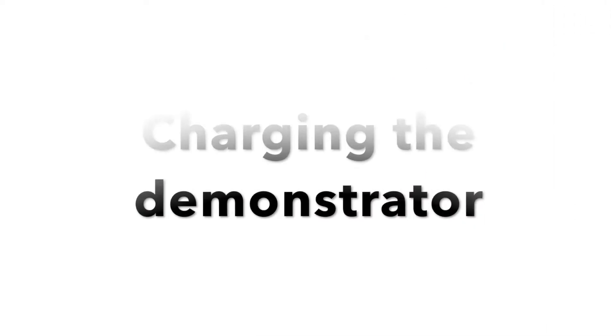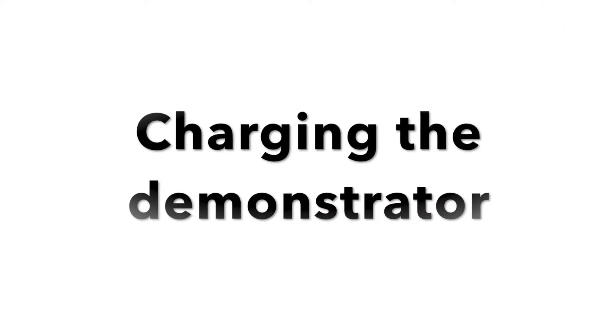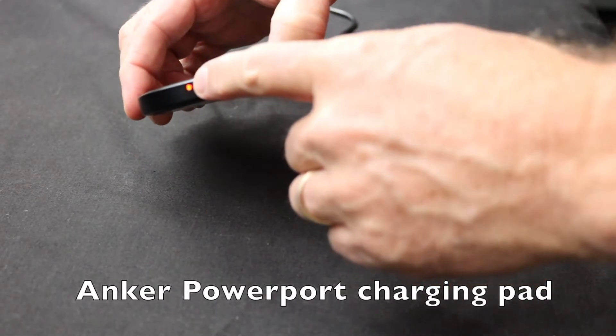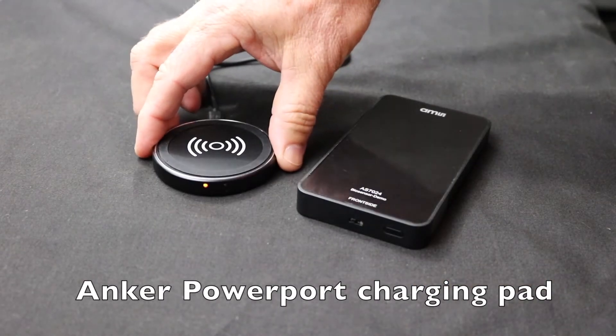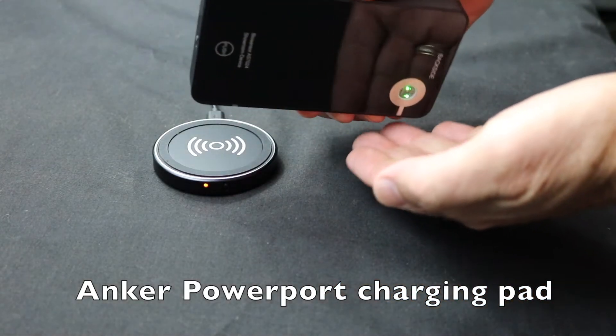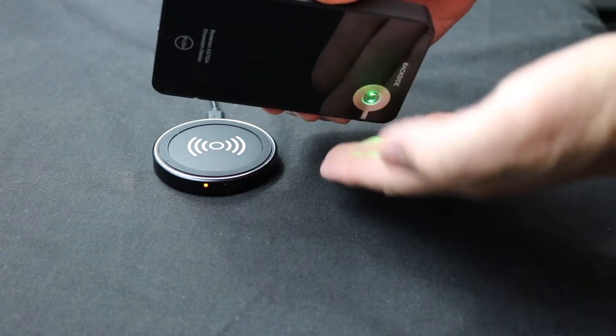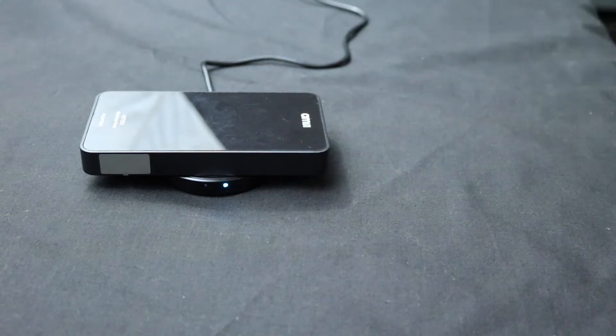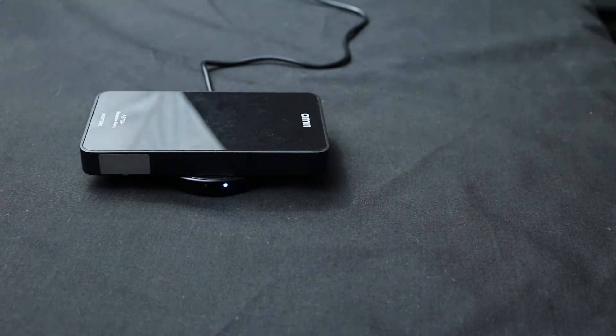The AMS blood pressure mobile demonstrator contains a lithium polymer battery and is charged using an Anchor Power Port wireless charging pad. To charge, the demonstrator is switched on and placed on the charging pad. The charger LED starts out red but will turn blue when the demonstrator is positioned correctly on the charging pad.